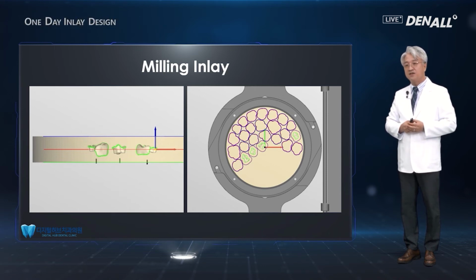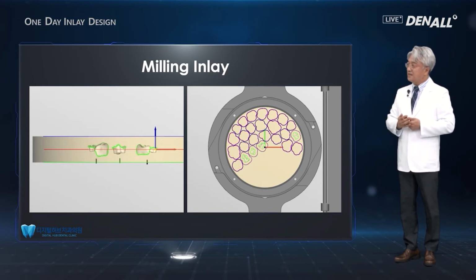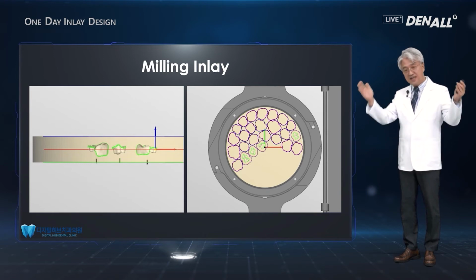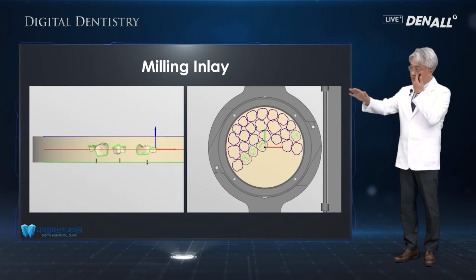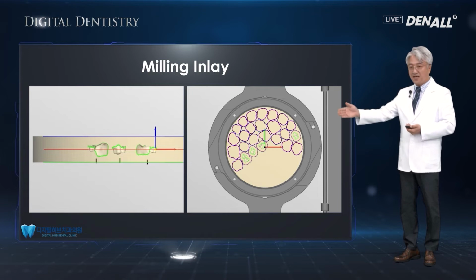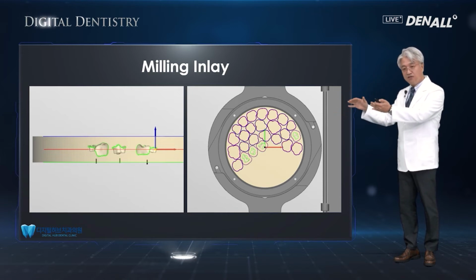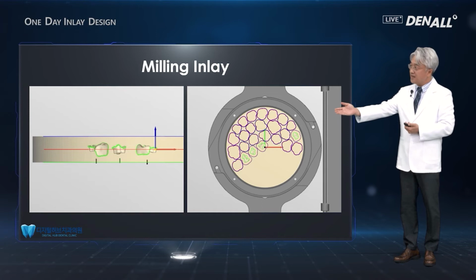In previous lecture, I talked about the CAD-CAM system and told you that CAD and CAM system do exist, but the design software is CAD, and using the milling machine doing the production. And with the milling or 3D printing, before you do that step, the software used for operating that is the CAM side. So this is CAM.